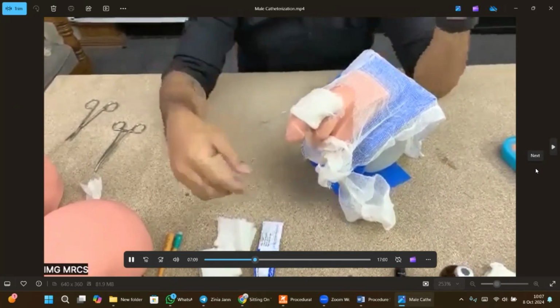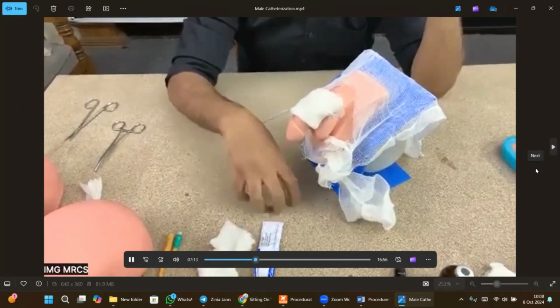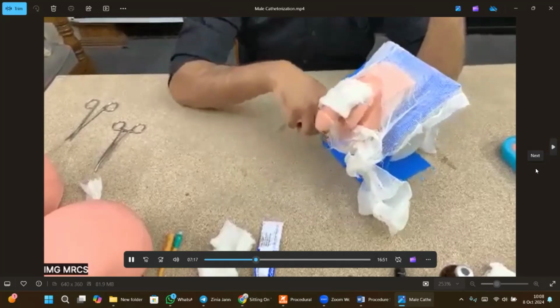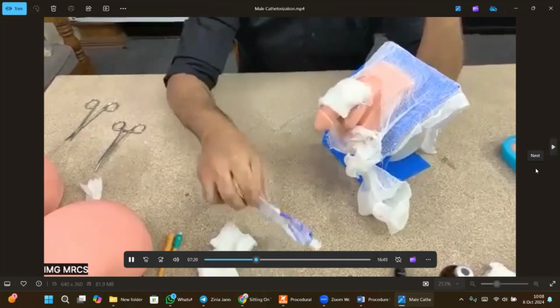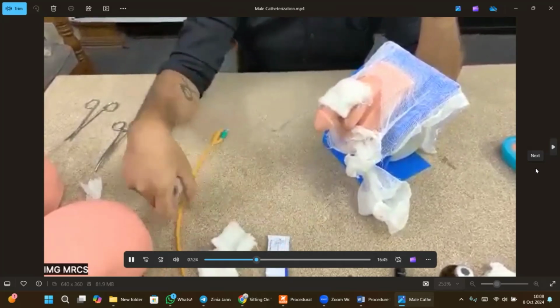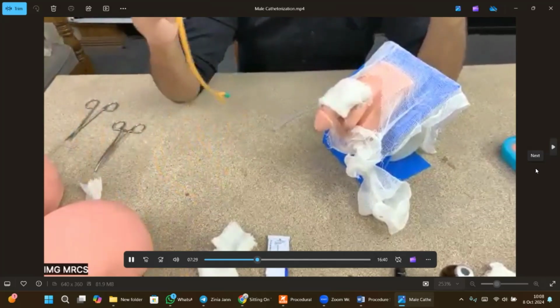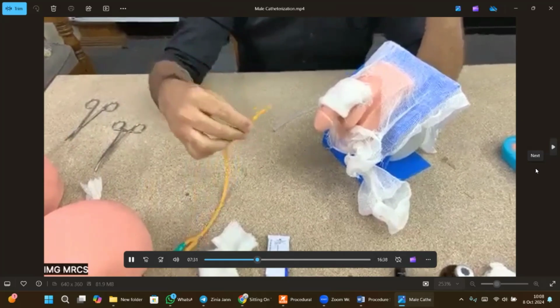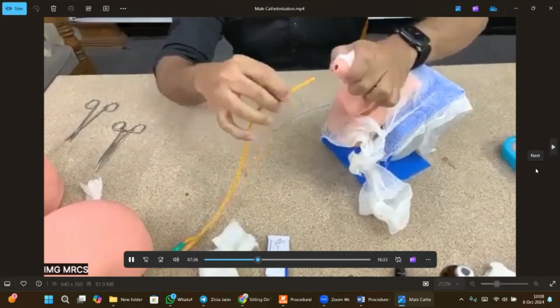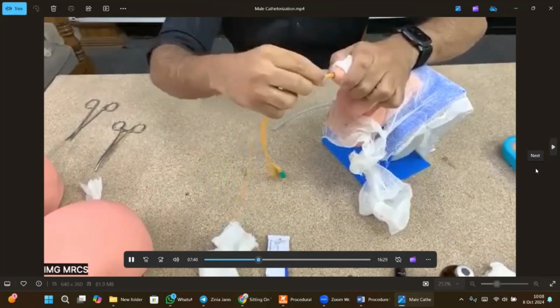After this, you are going to put a kidney tray between the patient's legs, and then you are going to ask for the catheter. And always remember, for the Instillagel, for the catheter, you are going to ask for what? Expiry date. Expiry date of the catheter and everything you are going to use. Now at this point, we have to hold the patient's penis like this. Then we are going to introduce our catheter simply just like this, a little bit.